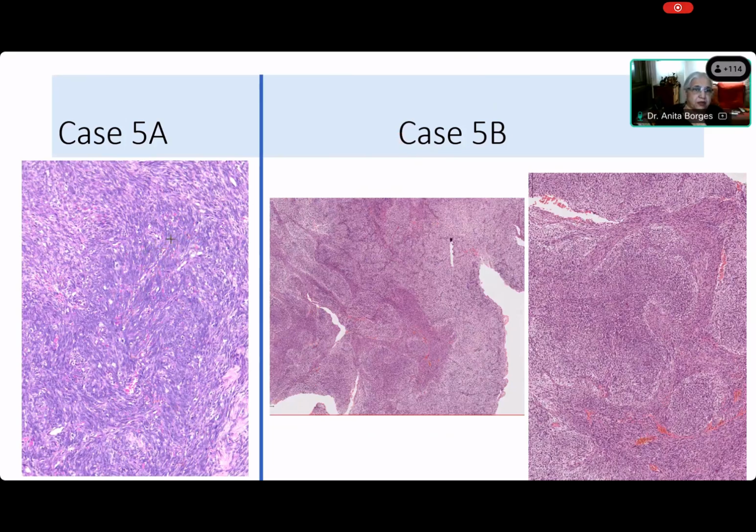If you think that this is a herringbone pattern, that here is the spine, and I'm seeing some things like this, no, you're not seeing it. These are just fascicles that are radiating away from an area. Okay, come on. What are you seeing now on the other side? They're also arranged in fascicles. Okay, but what kind of? These are just in haphazard fascicles on the left hand side.